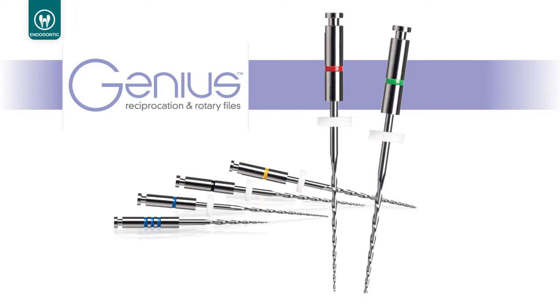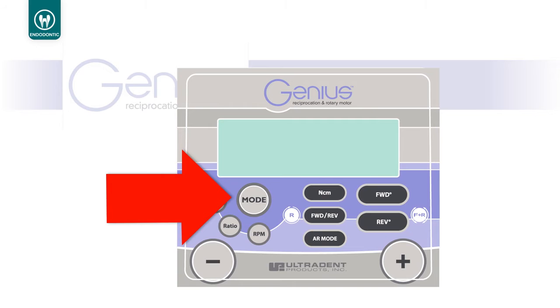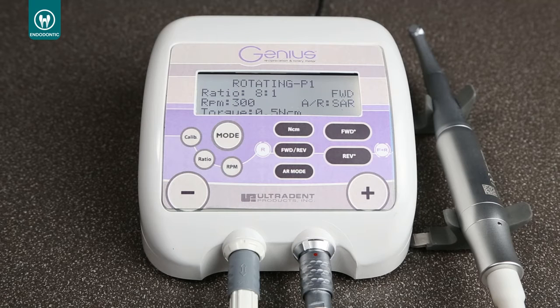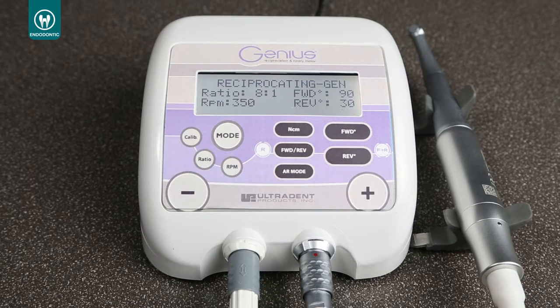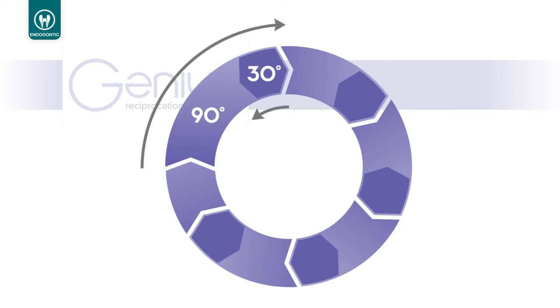After determining the working length and creating a glide path, the first file that we will use is the 25/04, the red one. Go to the Genius motor, press the mode button, going from rotation to reciprocation. We will use the 930 reciprocation. It means that in 90 you cut, 30 degrees you release the stress of the file.